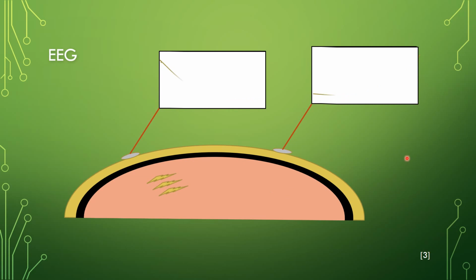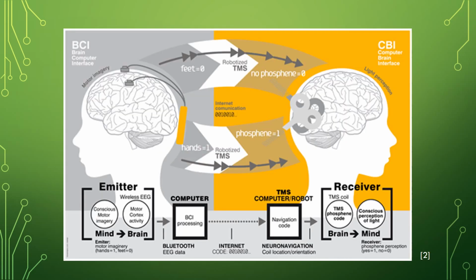These waveforms can then be filtered for features that may be of interest. And once you have those features, you can use them as inputs for a machine. An example of the application to this can be seen in this study done at Duke University.